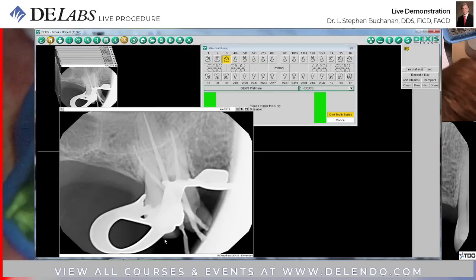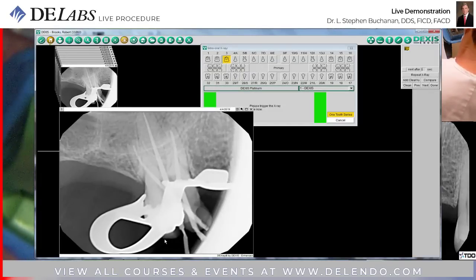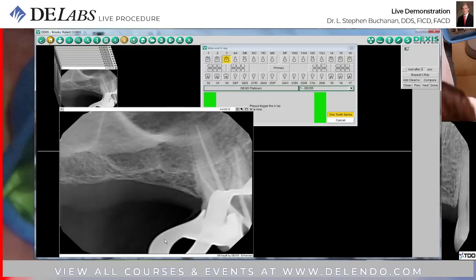MB, DB looks perfect, right? Can't see the palatal. Let's take a sky shot now. I'm going to go buy a lottery ticket.